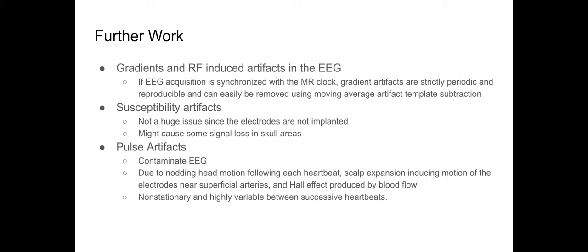So some further information. There are many artifacts with this technique. Gradient and RF-induced artifacts are often present in the EEG. But if the EEG acquisition is synchronized with the MR clock, gradient artifacts are strictly periodic and reproducible, and they can easily be removed using moving average artifact template subtraction. So gradient artifact is pretty easily removable.